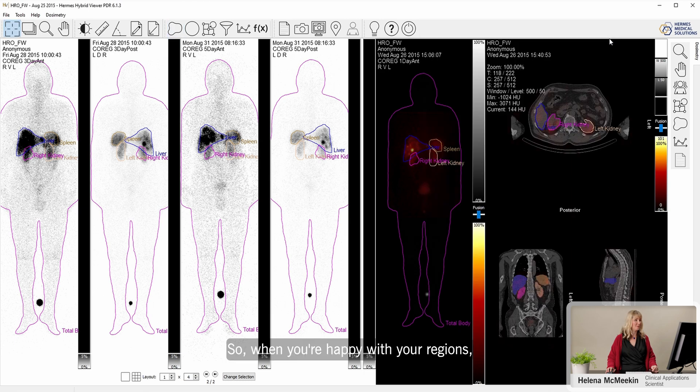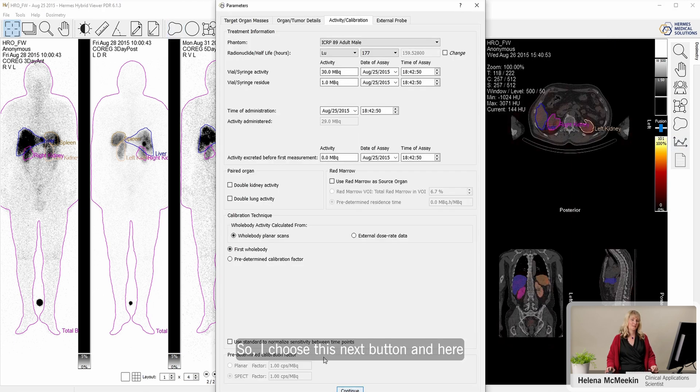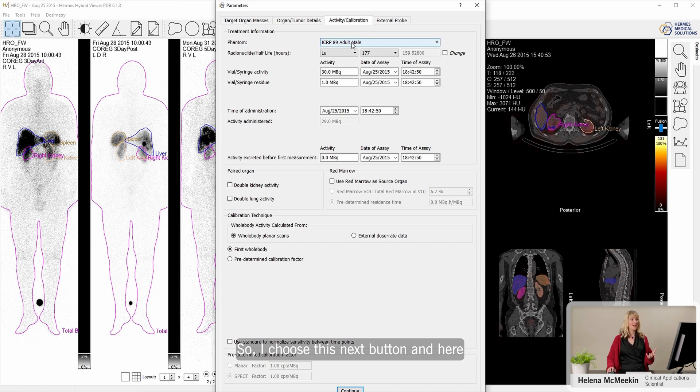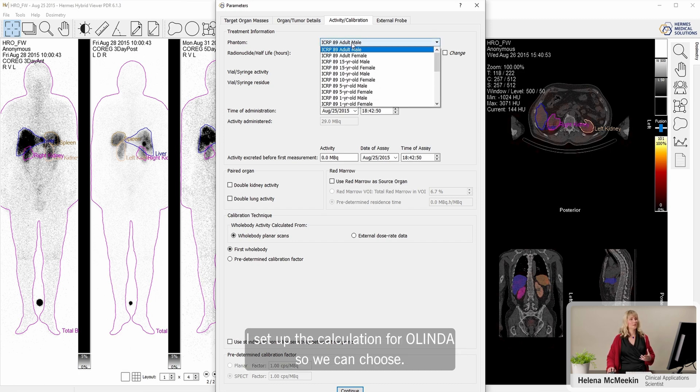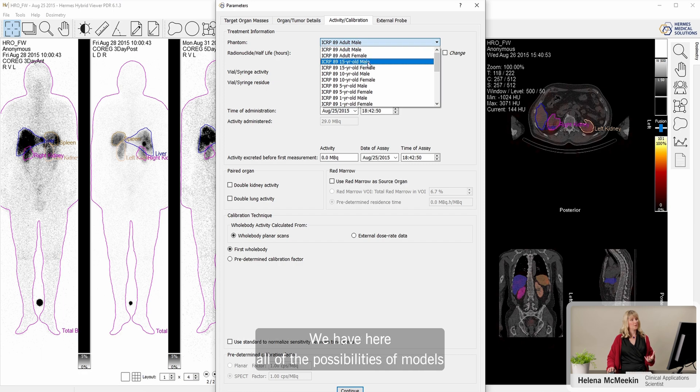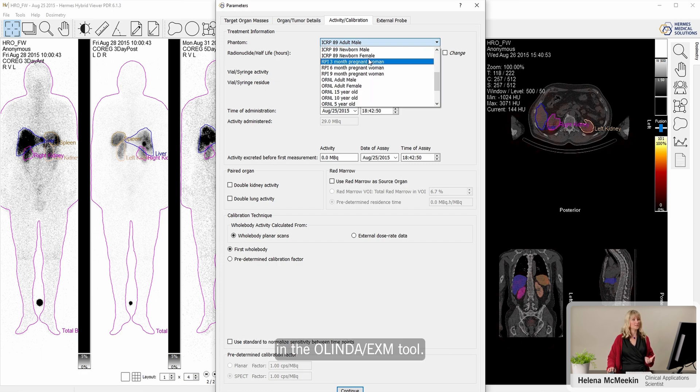When you're happy with your regions, we can go on to calculate the dose. So I choose this next button, and here I set up the calculation for Olinda. We can choose, we have here all of the possibilities of models in the Olinda EXM tool.